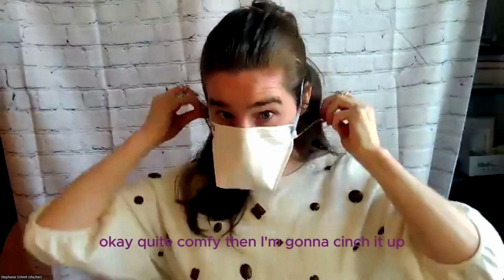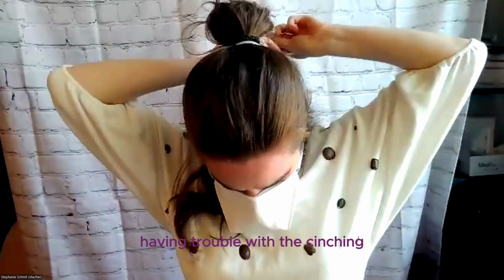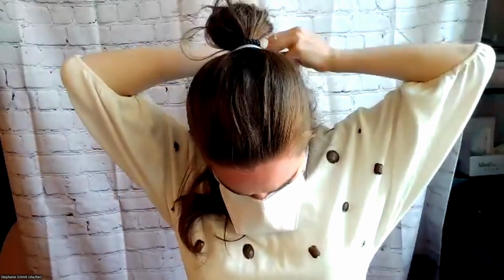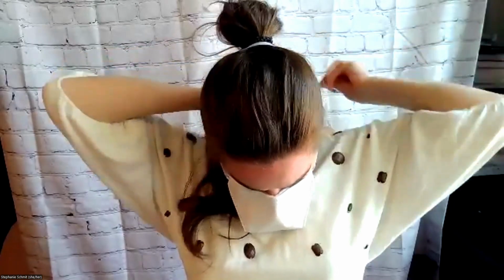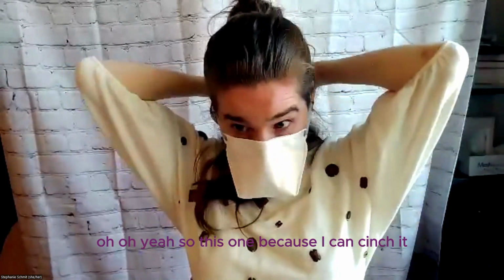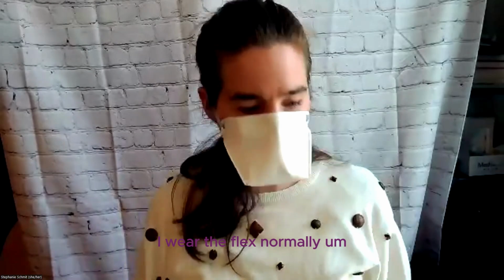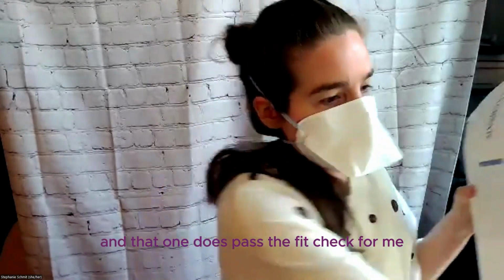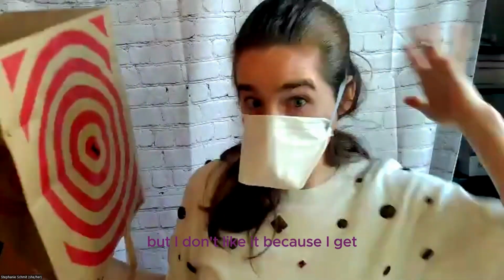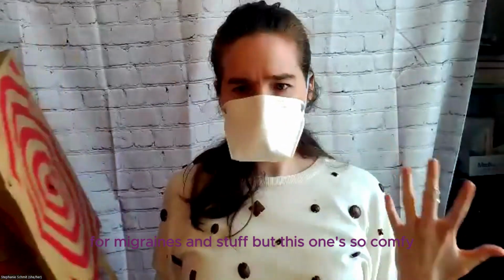Okay, quite comfy. Then I'm going to cinch it up. Having trouble with the cinching. Oh yeah, so this one, because I can cinch it, putting it right behind my neck feels good. That's just my personal opinion. I like this. This is so much more comfortable than I wear a V-Flex normally. And that one does pass the fit test for me. But I don't like it because the pressure on my head is difficult for migraines and stuff. But this one's so comfy.